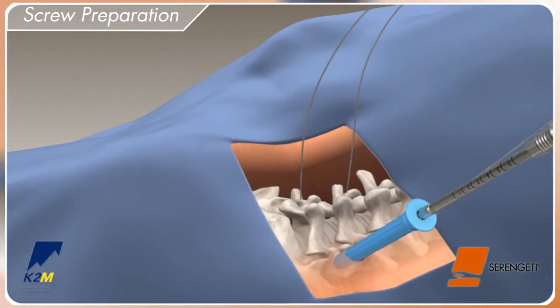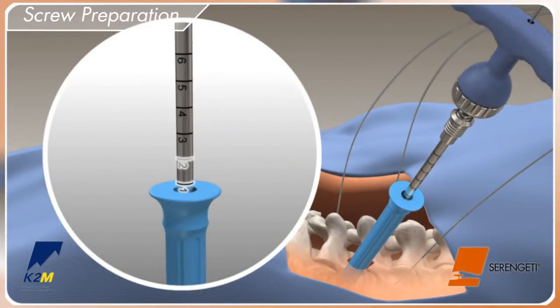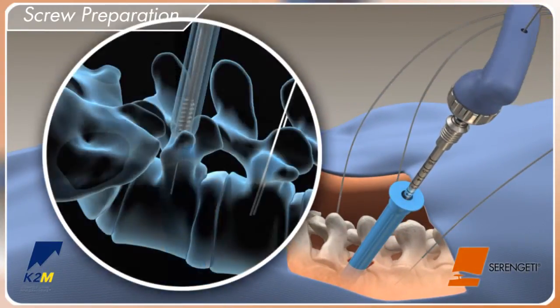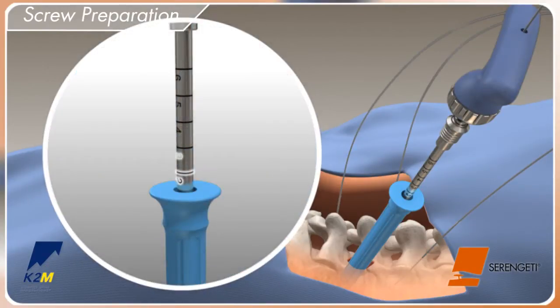Prepare the pedicle for screw insertion by advancing the all-tap over the guide wire and into the vertebral body to create a thread pattern. Take a lateral x-ray to ensure the tap is co-linear with the guide wire. External markings on the tap provide a reference for how far the tap has advanced into the bone.